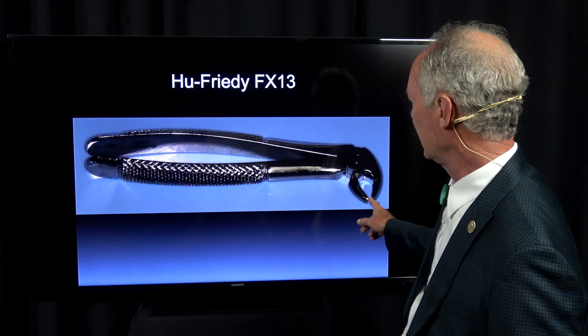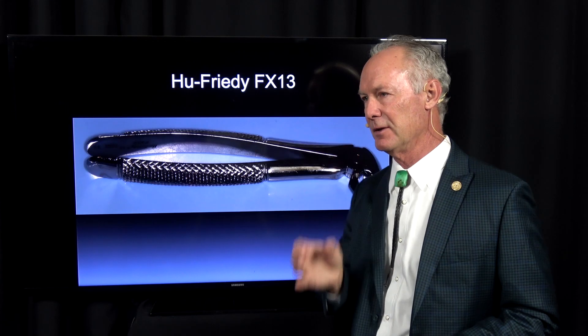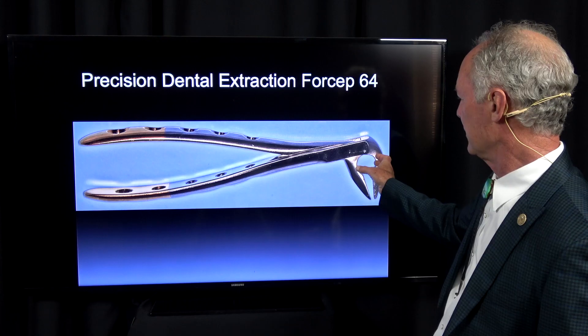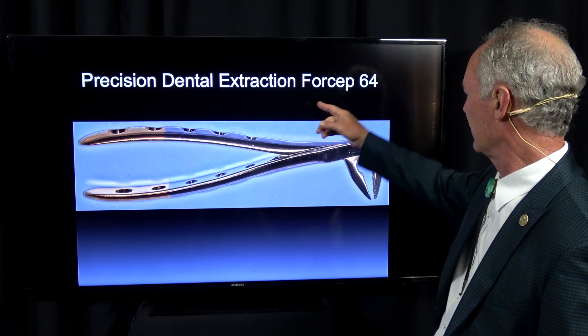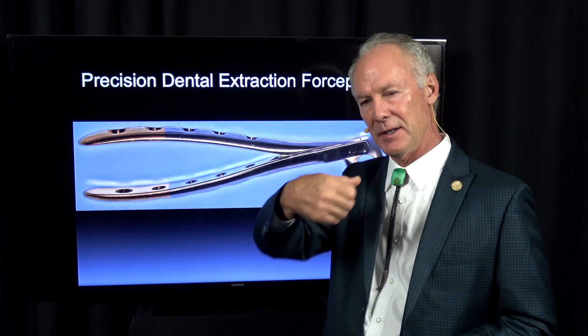This is a really handy instrument, the FX-13, for extracting anterior teeth. It's like a bird's beak and you just lower anterior teeth or upper anterior teeth — it's really good for that. This is sort of the same instrument with a different handle, the 64, and it's very good for extracting anterior teeth. You can unscrew them.